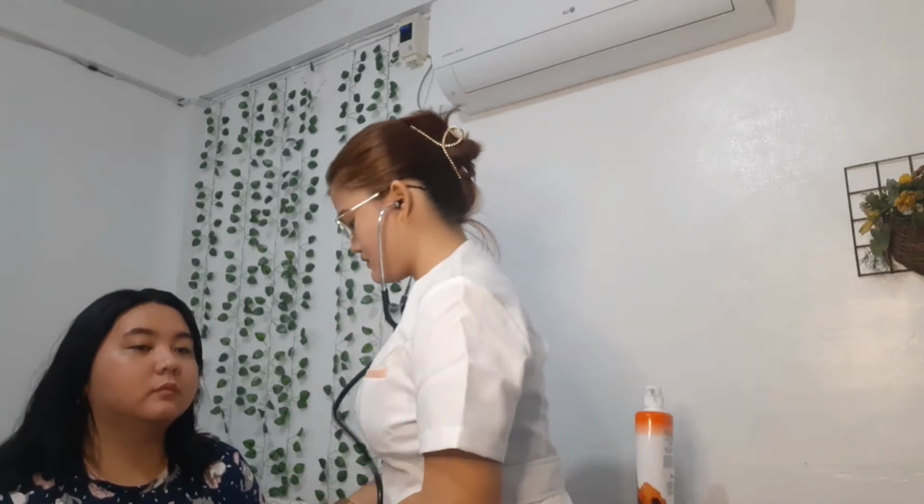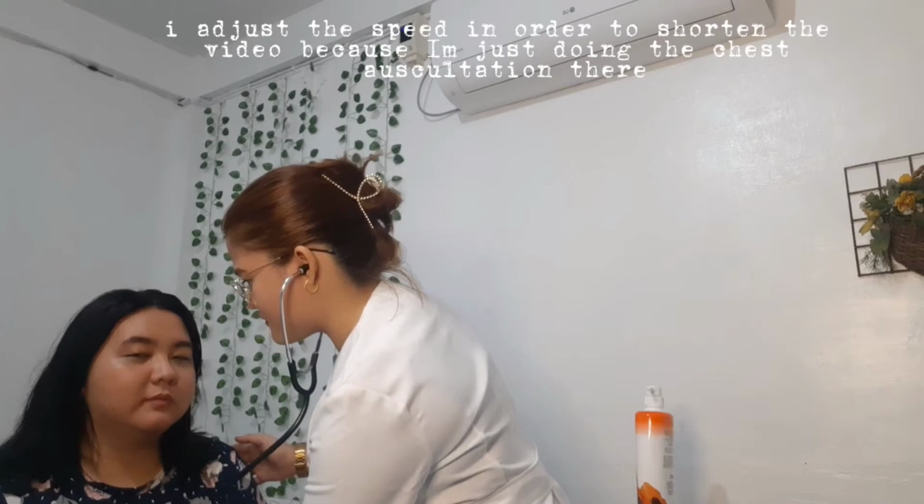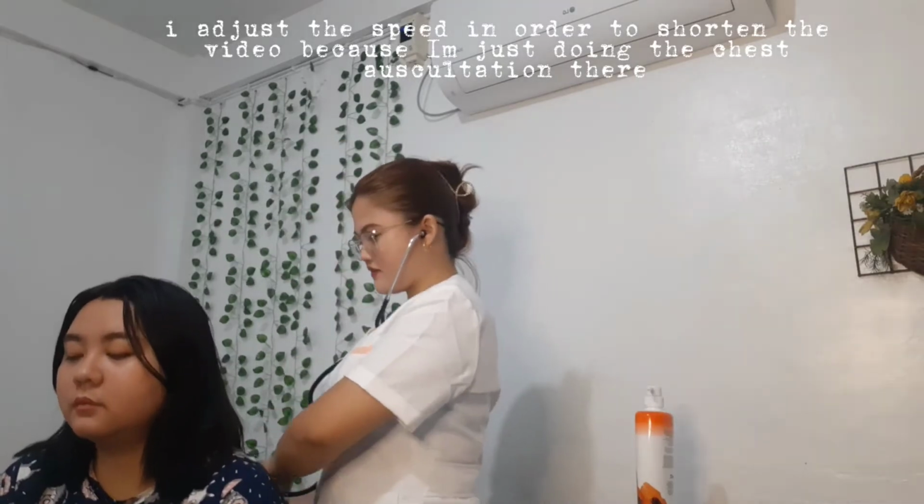For the chest auscultation, I adjusted the speed in order to shorten the video because I'm just doing the chest auscultation there. Based on my chest auscultation, as I have heard, there are no abnormal sounds or abnormality when it comes to her breathing.